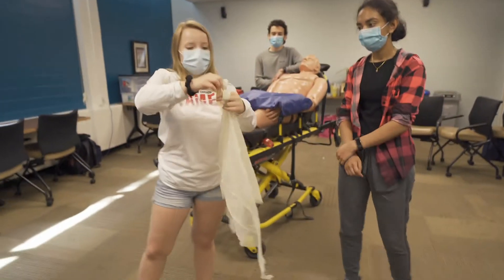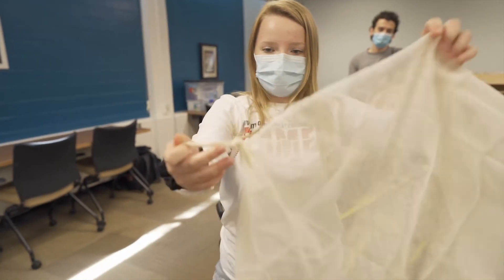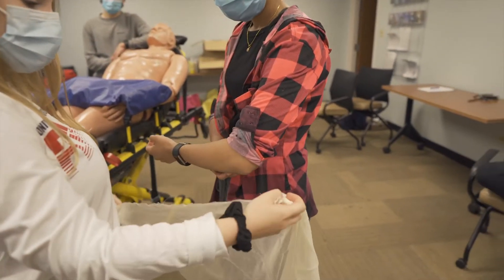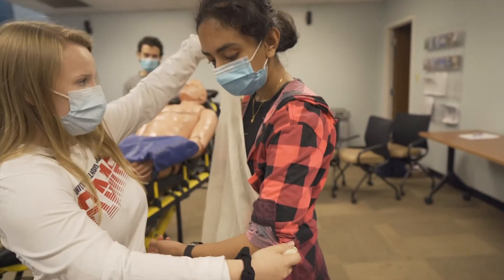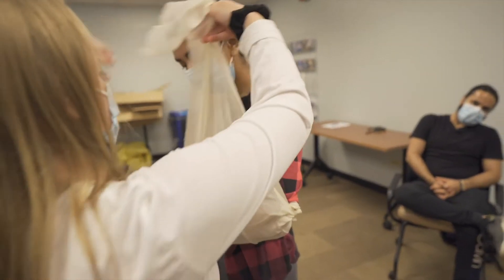Go ahead and tie that knot right now. Apply the knot to the affected arm — Diane's left arm has been injured. We're going to go under the elbow, and the part in Kimberly's left hand is going to go over the opposite shoulder, and the part hanging down is going to go over the affected shoulder.